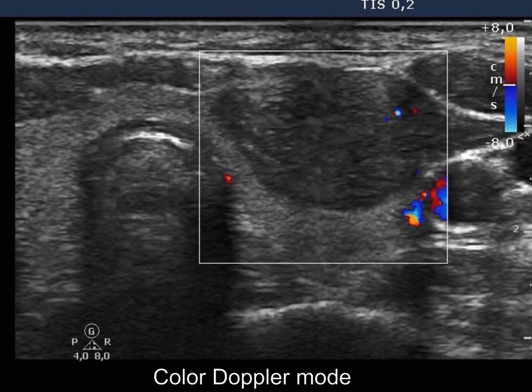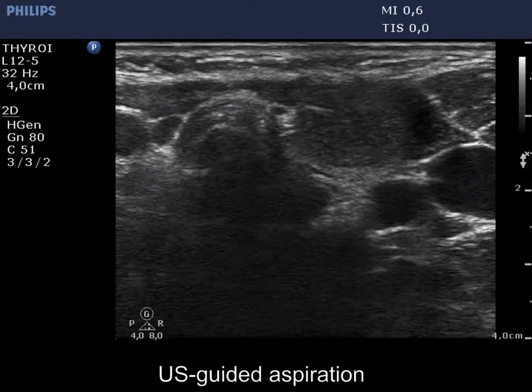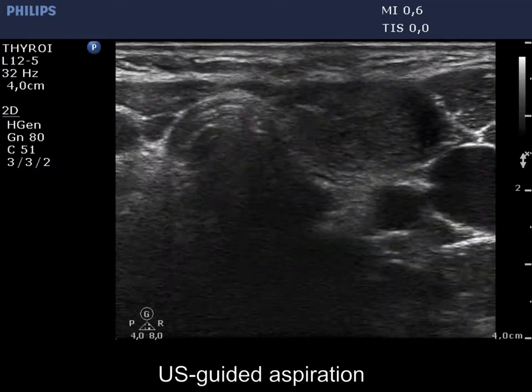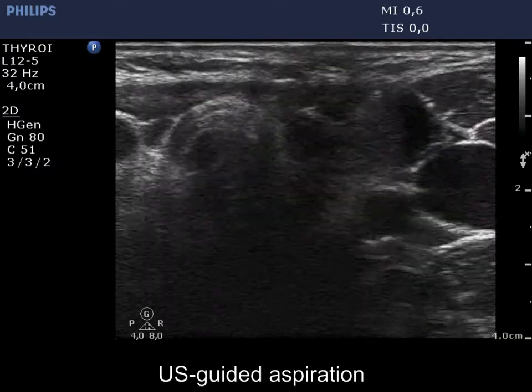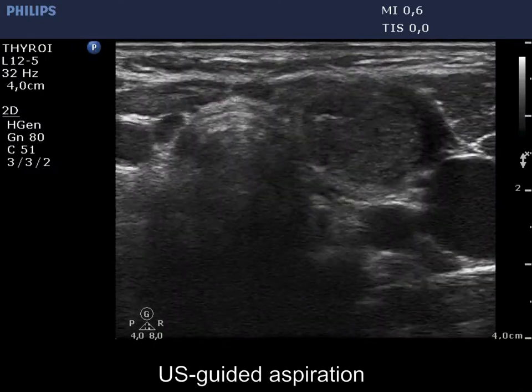The vascularity is scanty. Finally, an ultrasound-guided aspiration is demonstrated.